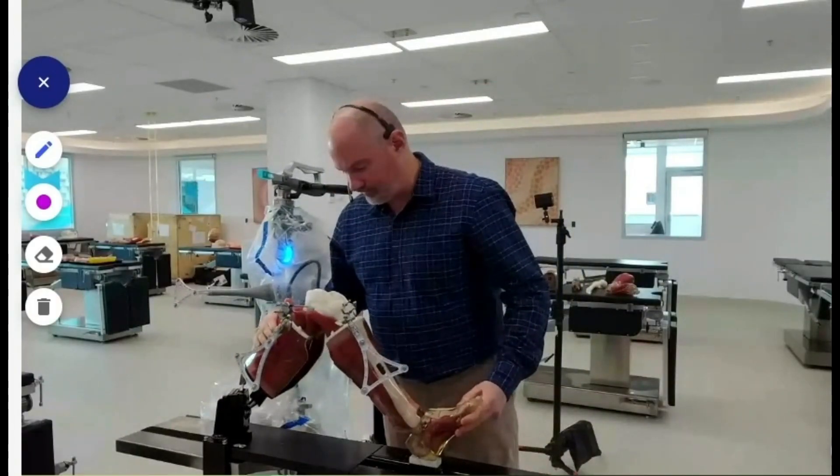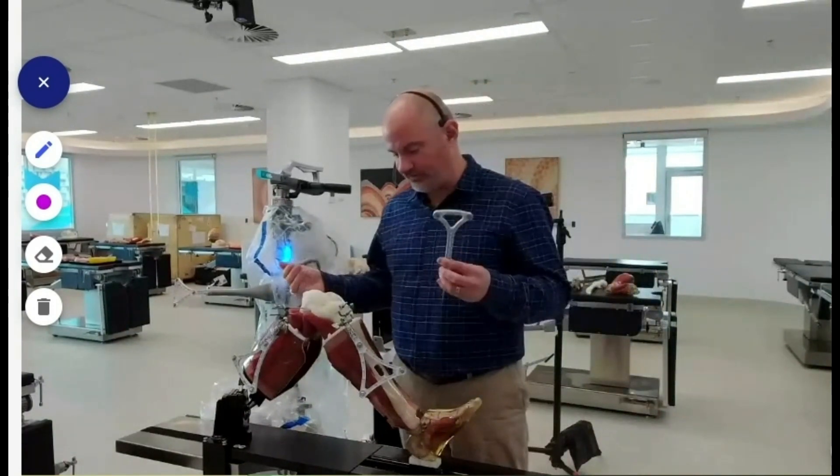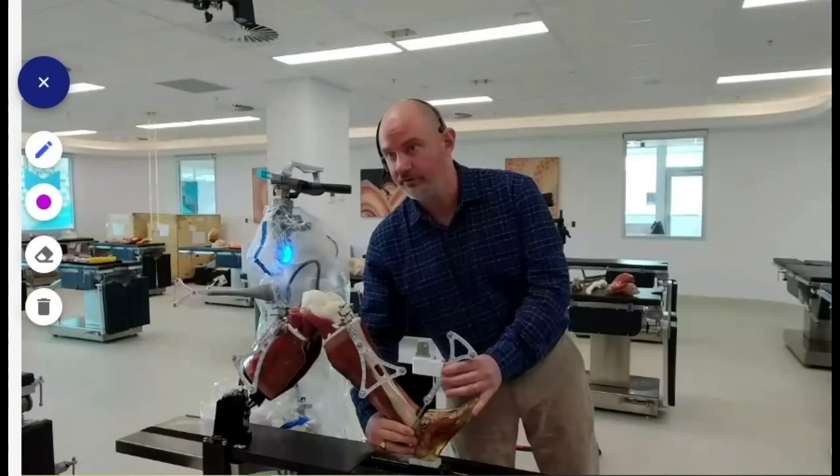The leg is very easy to manipulate, very easy to dock. The other great thing I'll show you in a minute is it has the ability to both extend and hyperflex — very straightforward to manipulate the leg, but also very realistic.